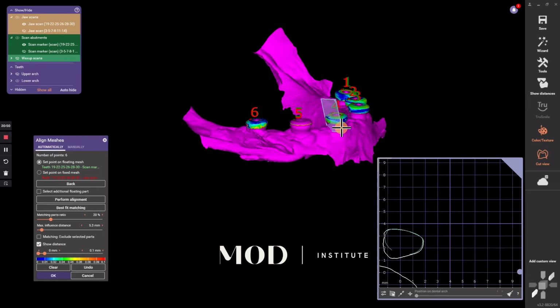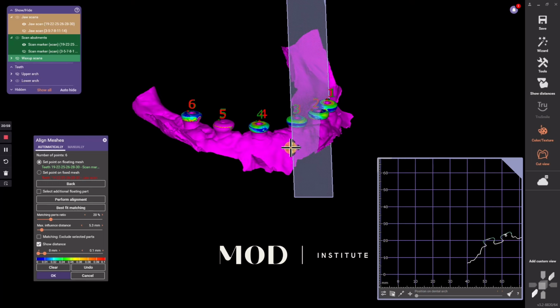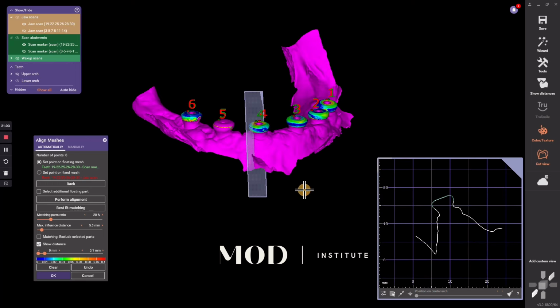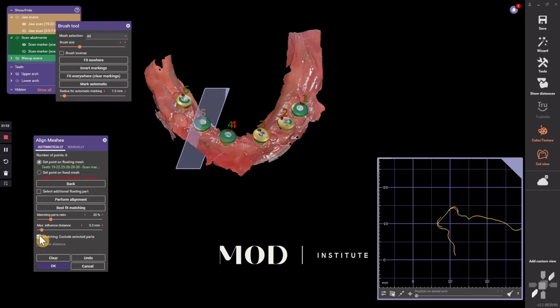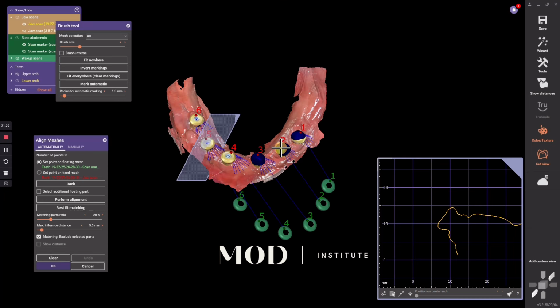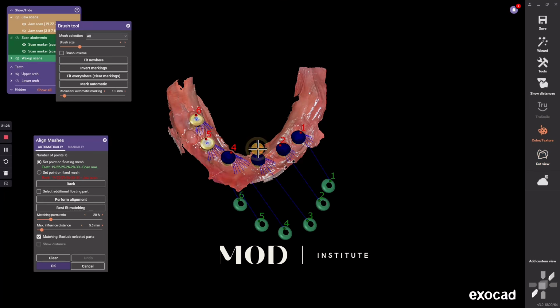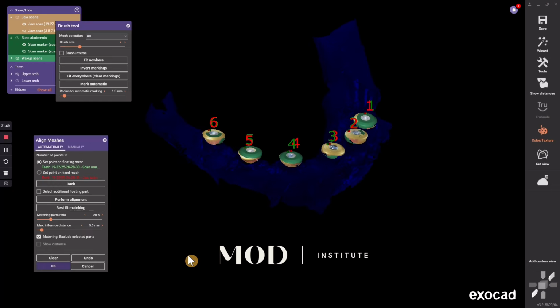And that is from an inaccuracy of my intraoral scan. So even under the best circumstances, your intraoral scan, you might find some inaccuracies here. And this is the whole point of shrinking the arch form and doing these hexagon scan bodies, because we're not actually using those locations. And even if I tell ExoCAD to just best fit match using only the scan caps, so here I'm selecting these surfaces, I'm going to invert it and then perform alignment again, I get the same discrepancy on that site 28.